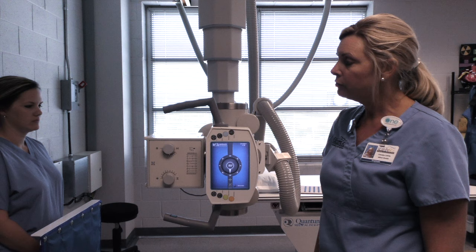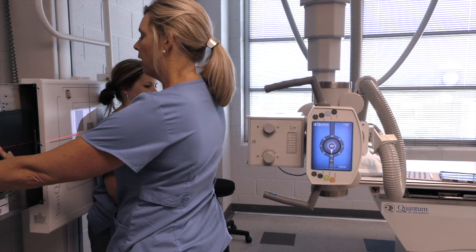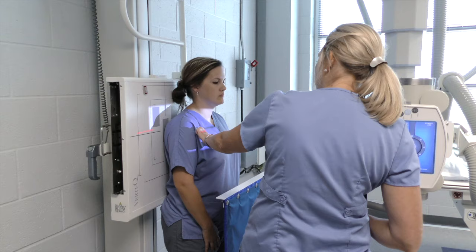We're going to do shoulder views: the AP shoulder internal, external, and then the scapula Y. Our SID is 40 inches and our cassette is a 10 by 12 crosswise — we'll have to change that out for the scapula Y view. Our centering is the coracoid process, an inch below it.